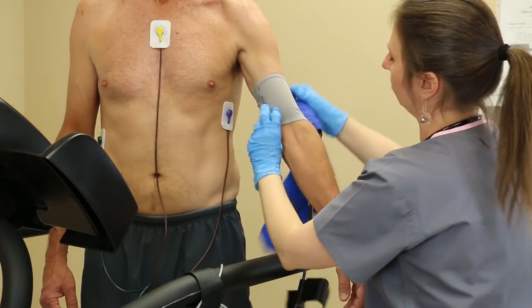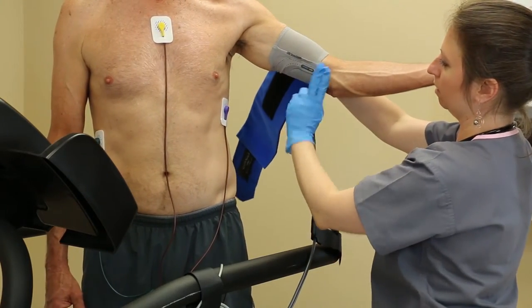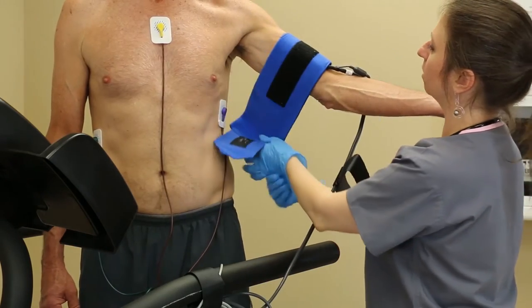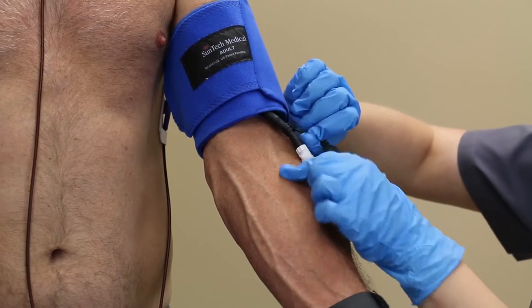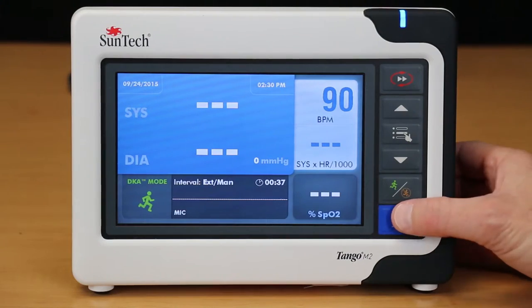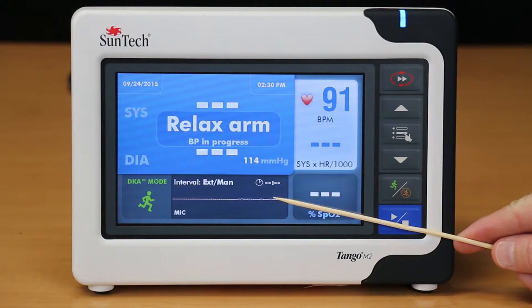Once you see the white dot next to the word Mike on the Tango M2 screen, go ahead and place the cuff on the arm of your patient with the microphone in between the bicep and tricep on the inside of the upper arm. Be sure that the microphone and pneumatic connections of the cuff are connected to the patient cable. Press the start button and look for the K sound to begin showing up in the K sound window at the bottom of the screen.